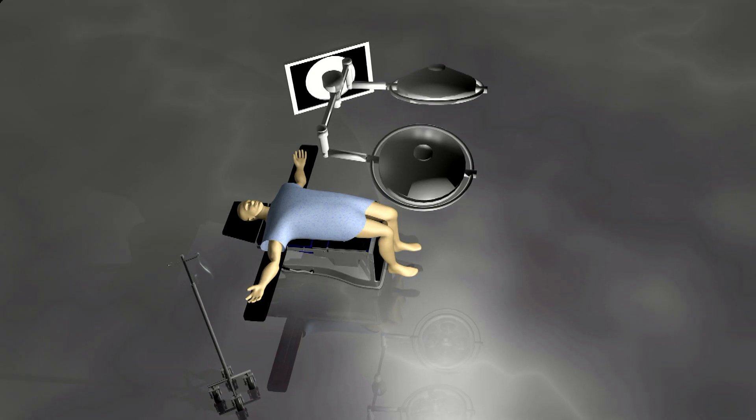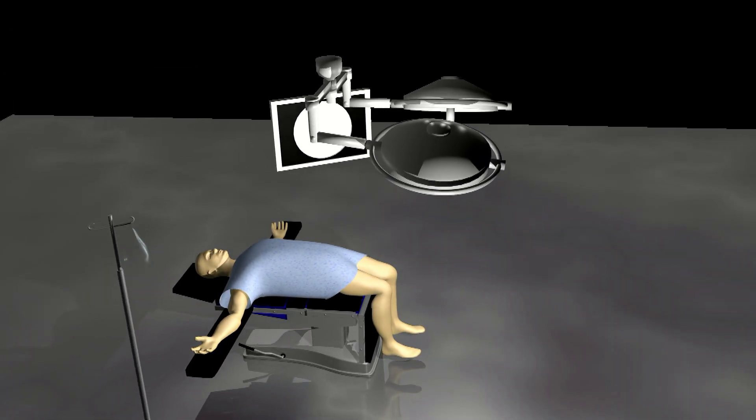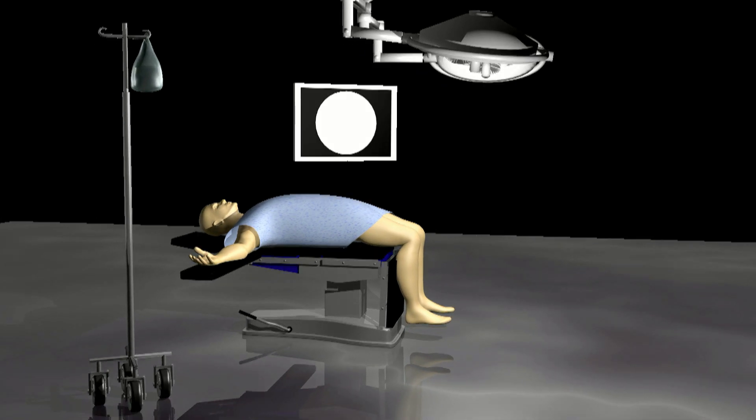Knee arthroscopy, or a knee scope, can be useful in the treatment of several causes of knee pain, including osteoarthritis, meniscus tears, and ACL tears.